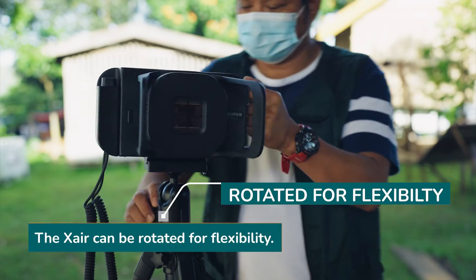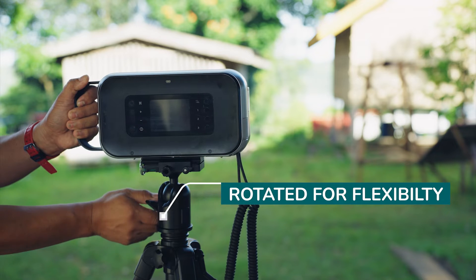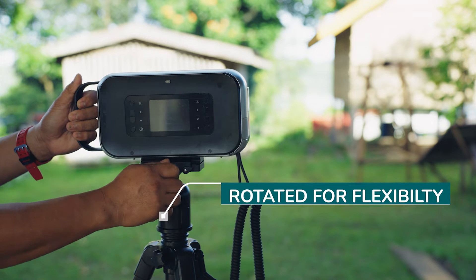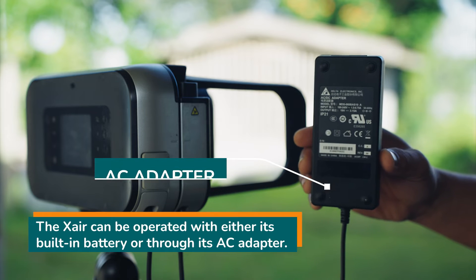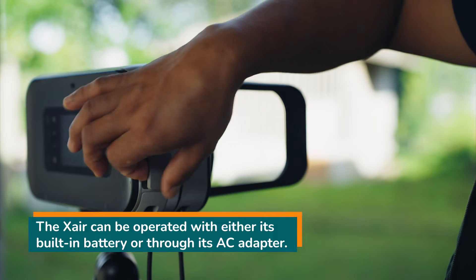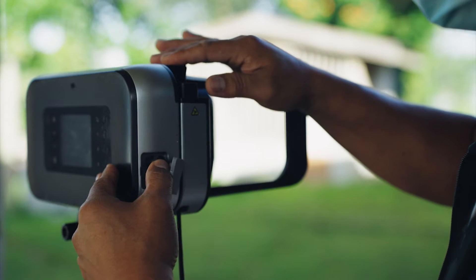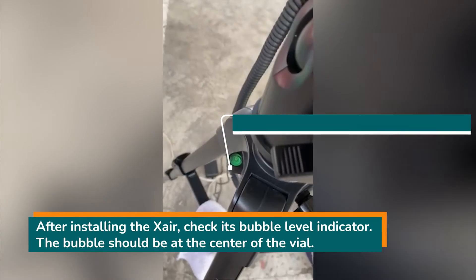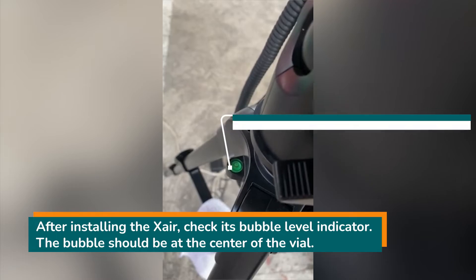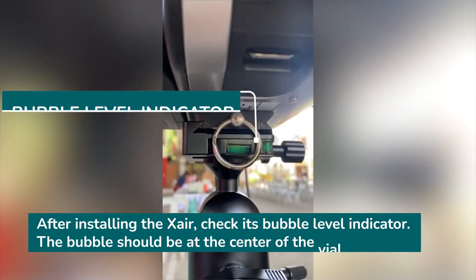The X-ray can be rotated for flexibility. The X-ray has a built-in battery, but you may also attach an AC adapter to the X-ray. After installing the X-ray, check the bubble level indicator located in the upper portion of the holder. The bubble should be at the center of the vial.